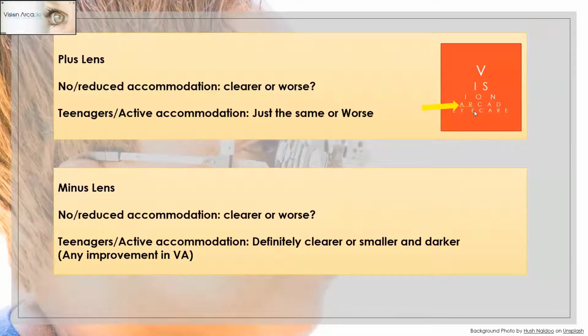So pick two letters and change your lens, say increase plus 0.25, and ask the patient, are those letters, because that's where the patient can read up to, clearer or more blurred? You make your decision based on that and not just on the whole line, because it makes it more difficult. We've got groups of patients, like when you're talking about refraction, doing the plus lens side.